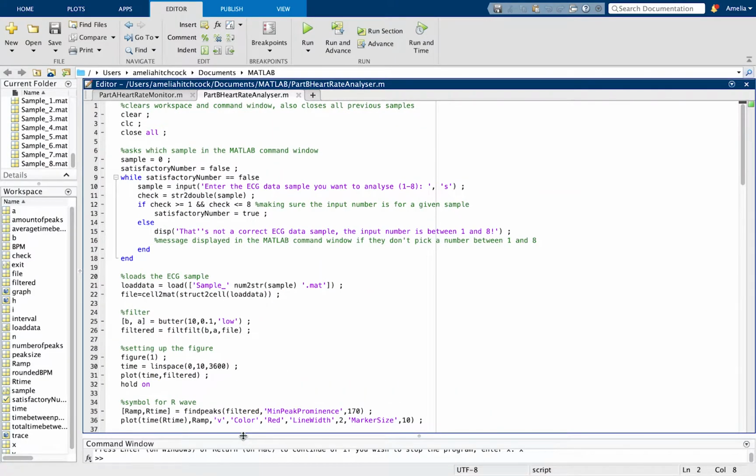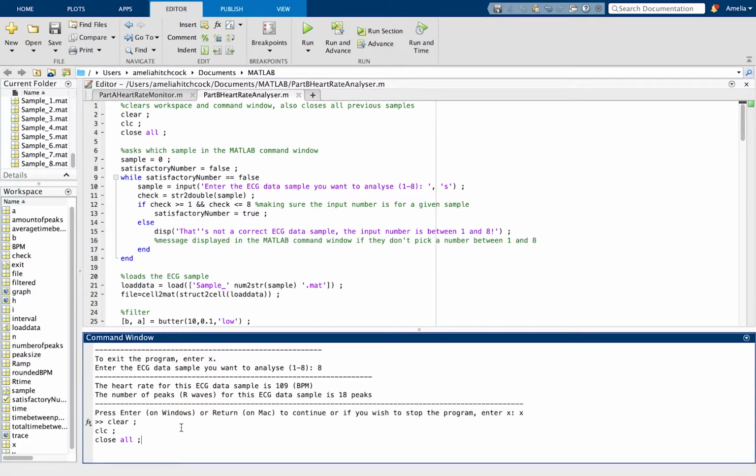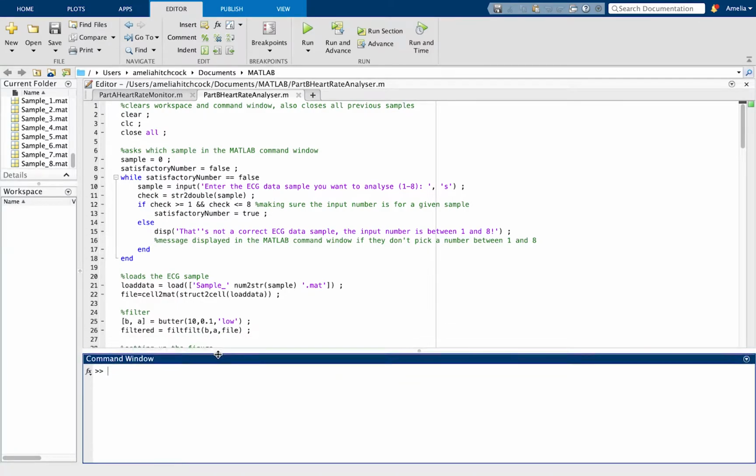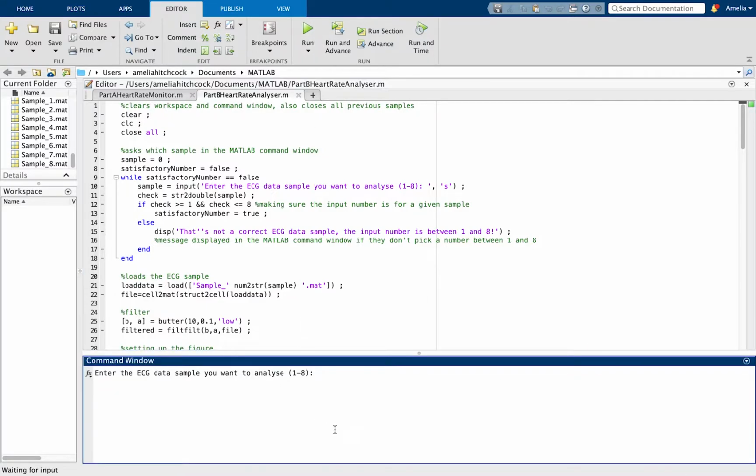Now we'll go on to part B. I'll just clear everything. Okay, so let's start with number 1.